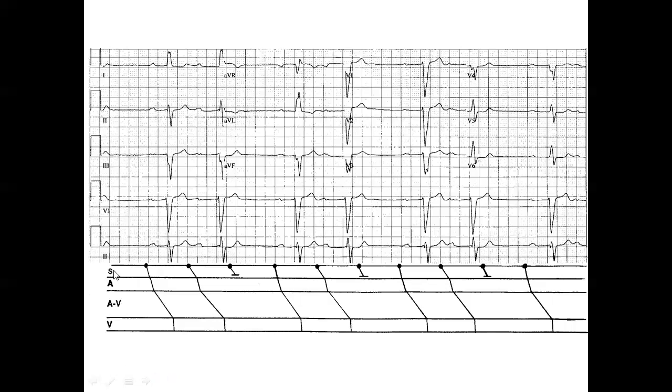Okay, again, I need a ladder in the sinus node. So sinus node fired regularly, promptly to atrium, then to the ventricle, delayed to atrium, but not only that, PR also lengthens. So this is dual level Wenckebach phenomenon. Wenckebach between the sinus node and atrium, also Wenckebach within the AV junction.